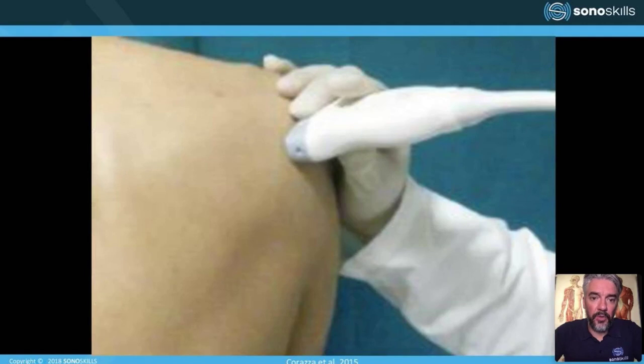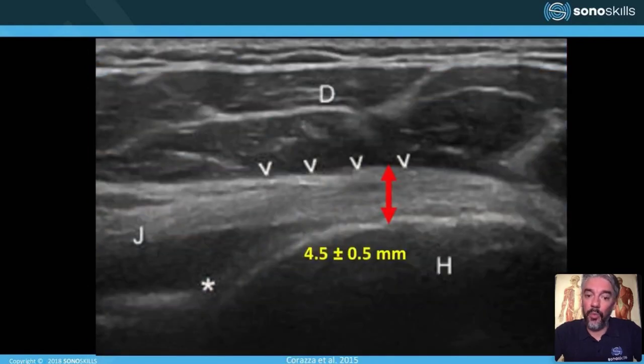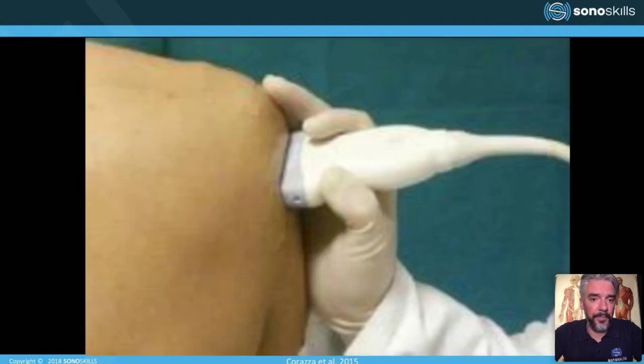Good. When scanning, like mentioned, oblique on top of the longitudinal infraspinatus, this is what we see. This is the infraspinatus and the thickness, and then we can see the internal aponeurosis inside the infraspinatus, and in the depth we can see the glenohumeral labrum. And when sliding down, the transducer a little bit more oblique, then you will end up in the teres minor.